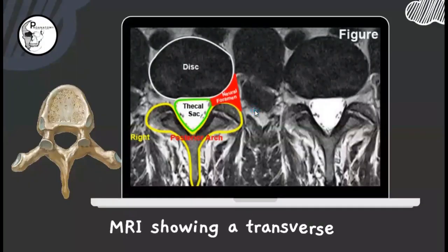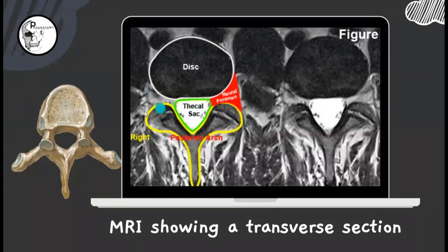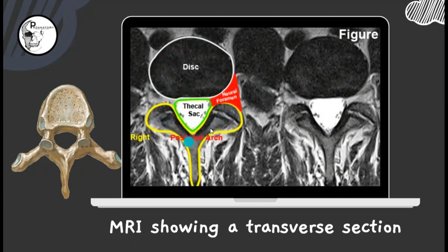Now let's look at an MRI transverse section of the spinal cord. Here you can clearly see the body of the vertebra, the posterior neural arch, the posterior spinous process, and in between, the vertebral foramen marked with colored lines for a better view. The body is covered by the intervertebral disc. The green colored area is the thecal sac — the outer lining of the vertebral foramen — with the spinal cord inside. The red marked area represents the neural foramen through which the spinal nerve roots emerge.